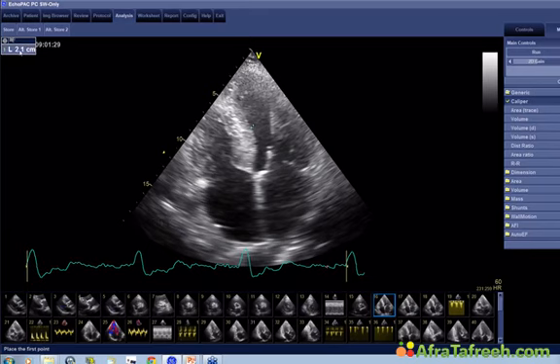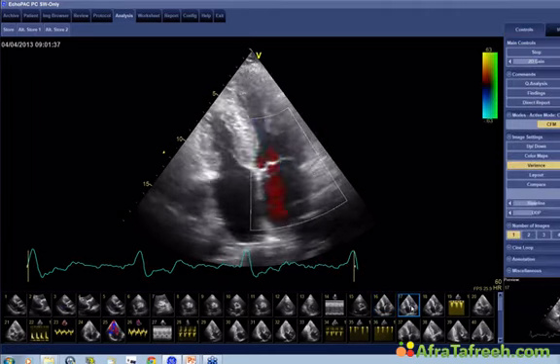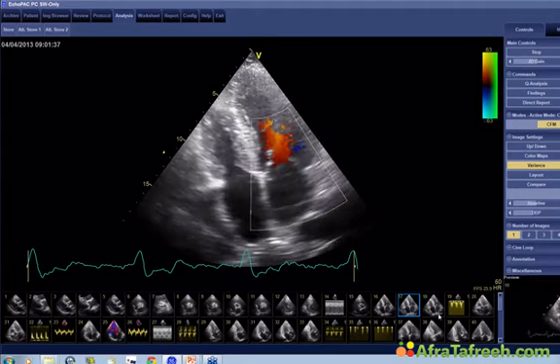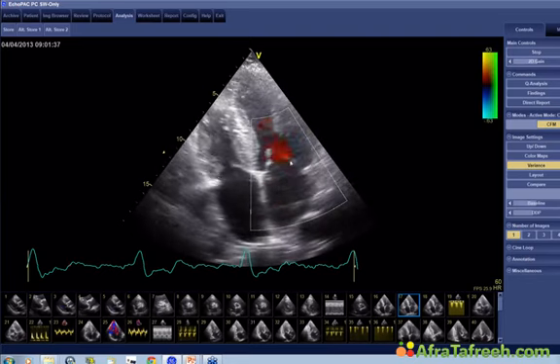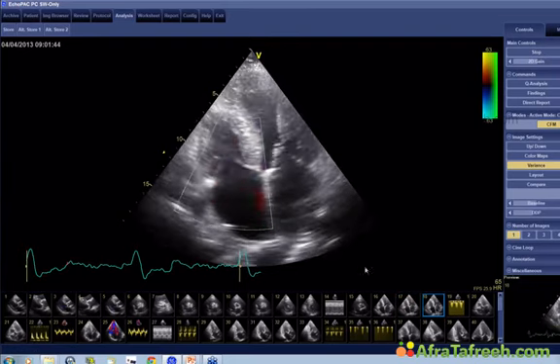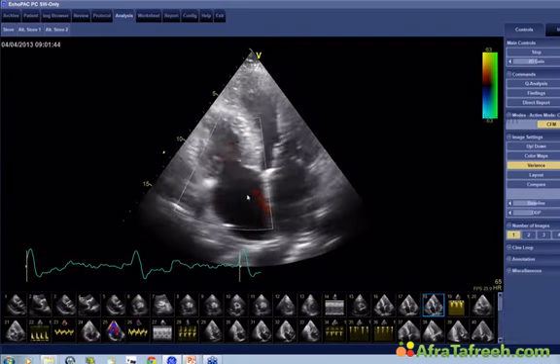It's 21 millimeters, which is a lot. Remember, normal we have 11, maybe 12, and even in many forms of severe aortic stenosis, you might only have 16, 17, and 21 is very, very much. So very severe left ventricular hypertrophy. There is only mild mitral regurgitation. You don't see very much flow convergence here. There is only mild tricuspid regurgitation.